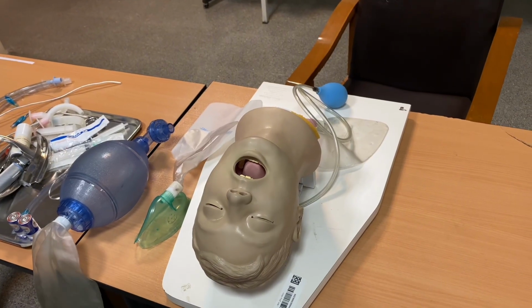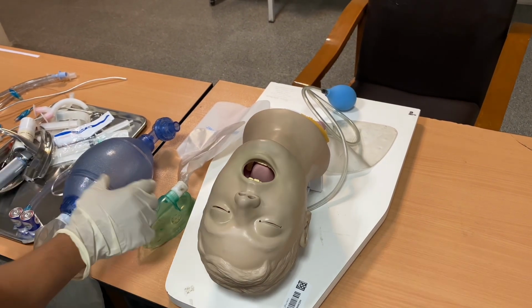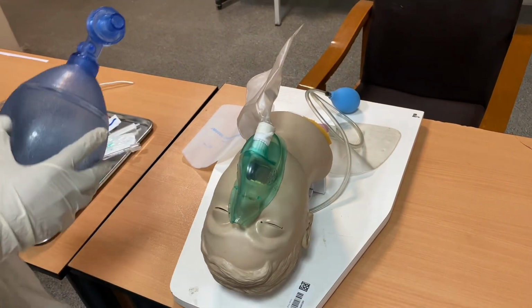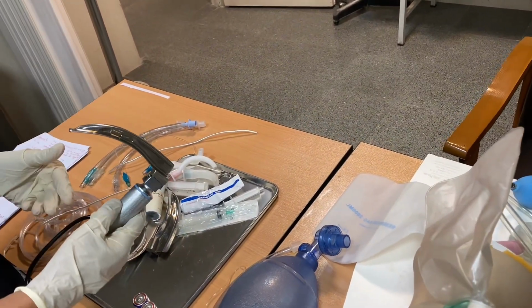Before we start the procedure, we will make sure that we have all the necessary equipment and that it is functioning properly: an appropriate size mask for oxygenation, a self-reinflating resuscitation bag, an endotracheal tube, and a laryngoscope.